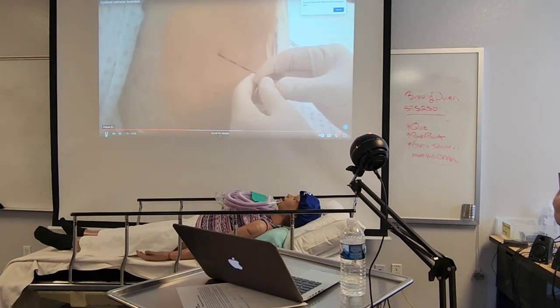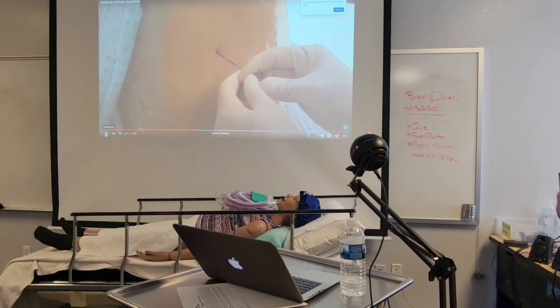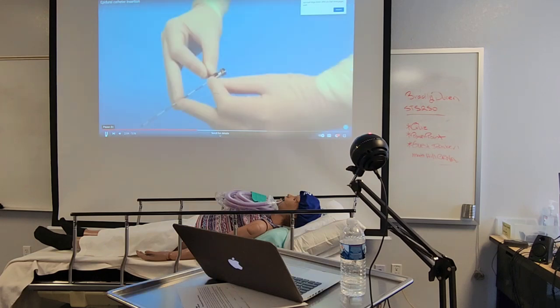With the stylet in place, insert the epidural needle through the same entry point that you used with the finder needle. The purpose of the stylet is to prevent the tip of the epidural needle from becoming obstructed by patient tissue. One technique involves holding the epidural needle with the bevel facing up, using both hands, with the thumbs and index fingers holding each side of the hub.